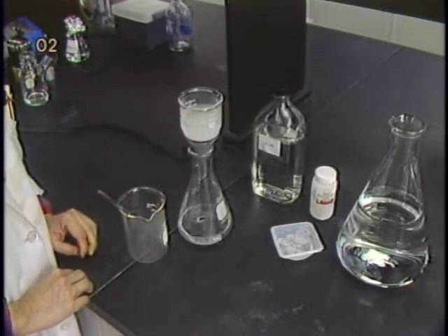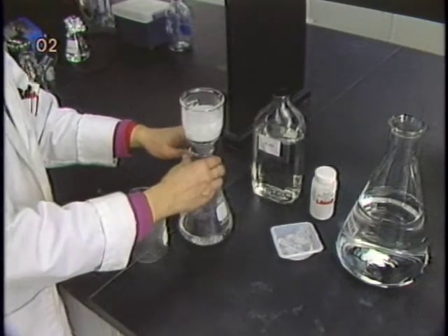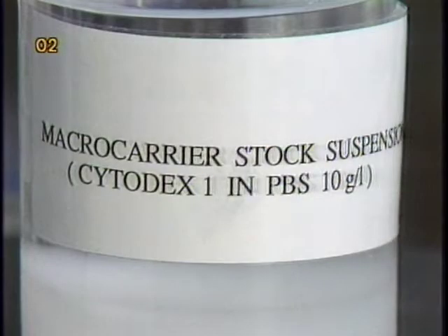Microcarriers in the form of dry beads are first hydrated and washed thoroughly. Suspend and resuspend the microcarrier in phosphate buffer saline before autoclaving. A microcarrier stock suspension at a concentration of 10 grams per liter in 1 liter or 500 milliliter bottles is convenient to use, and can be autoclaved at 121 degrees for 20 minutes.